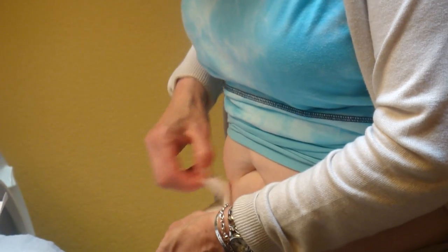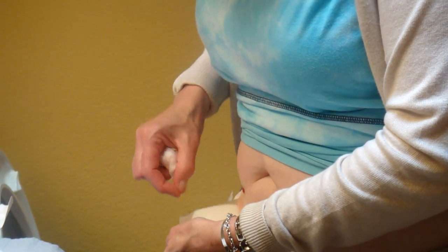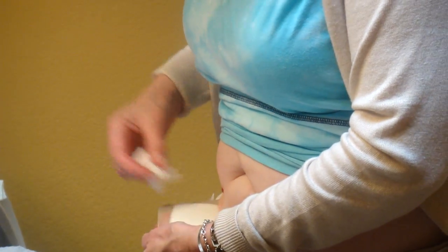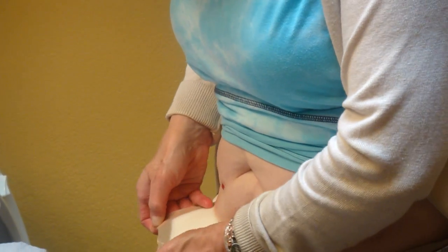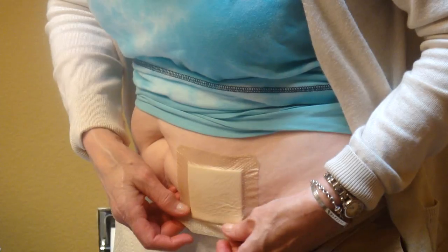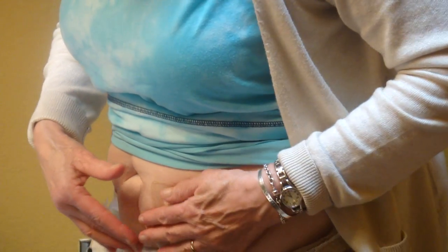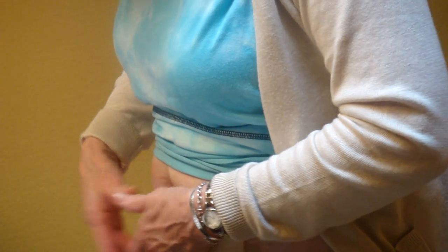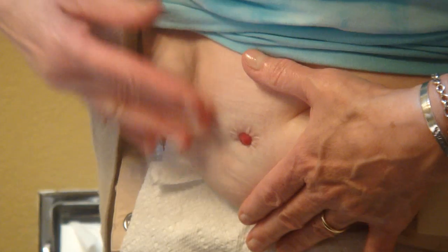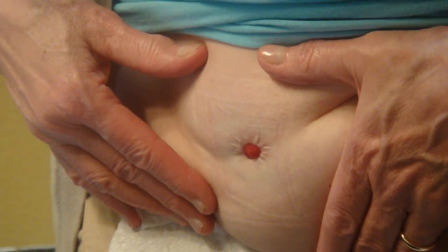I'm going to take this dressing and pull off the old gauze. There's a little bit of mucus on there and a little bit of blood today — very minor. Occasionally, maybe once a week, I might see a little blood. It's no big deal. I'm going to pull off this dressing and stick it over here on the other side of my abdomen — a friend gave me this great tip. If you look at my stoma, you'll see it's very flat, flush to the surface of the skin. It's about the size of a dime and has a little starburst effect around the outside.